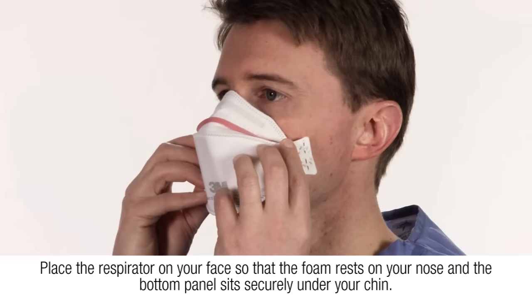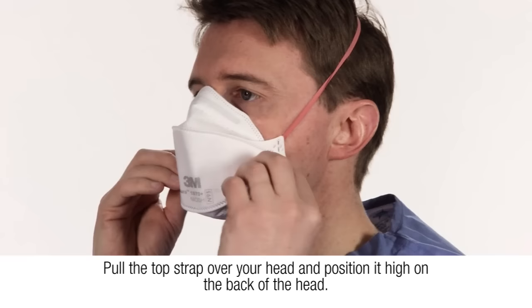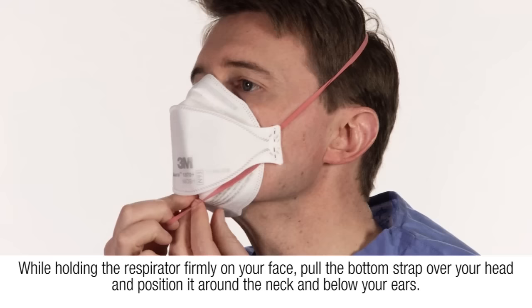Place the respirator on your face so that the foam rests on your nose and the bottom panel sits securely under your chin. Pull the top strap over your head and position it high on the back of the head while holding the respirator firmly on your face.